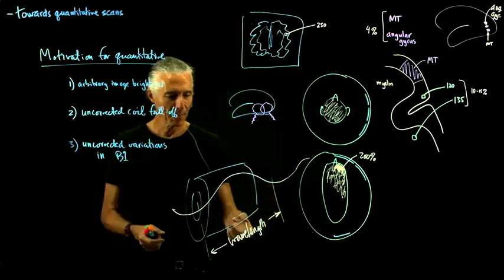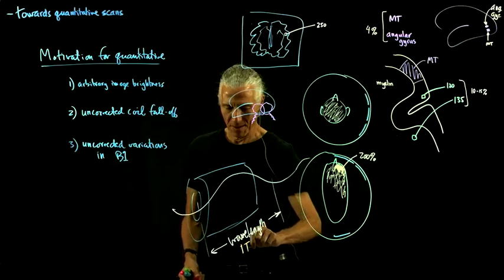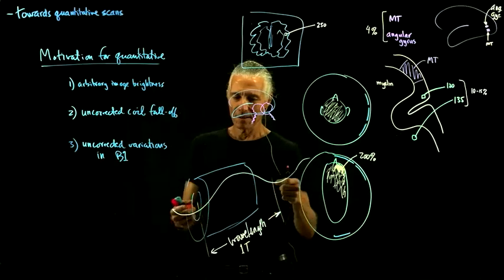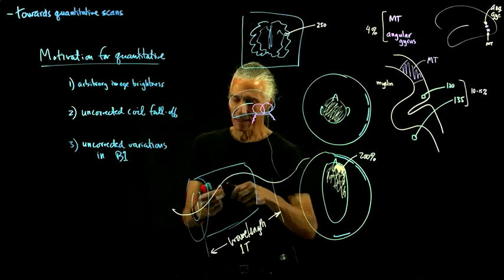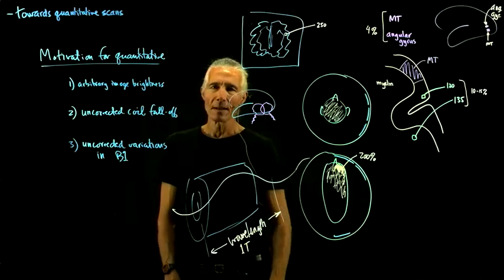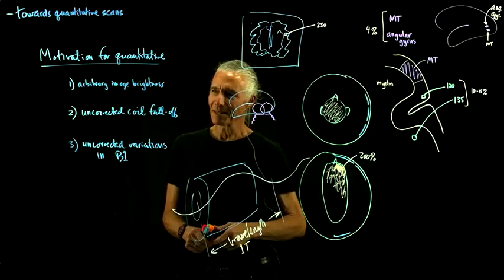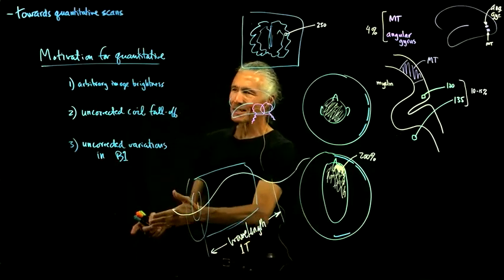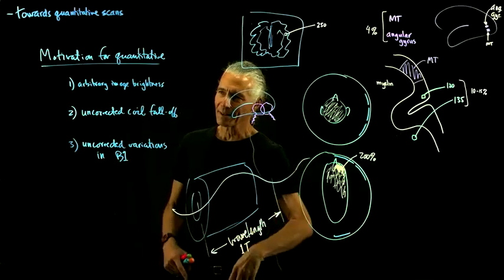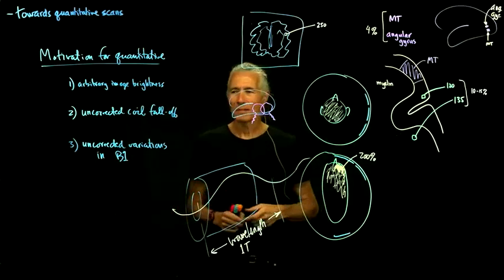And this starts to happen already. So this is wavelength at 1 Tesla. At 3 Tesla, it's going to be 1/3 the wavelength, and so it's going to start to resonate around inside the cavity of your head. At 7 Tesla, it's worse. So at 7 Tesla, this is a story I always tell. If you stick your feet in the body coil and you have your head out of the body coil, and you do RF on your feet, it will resonate around in your body and make a signal come out of your head. So that's a bigger problem.